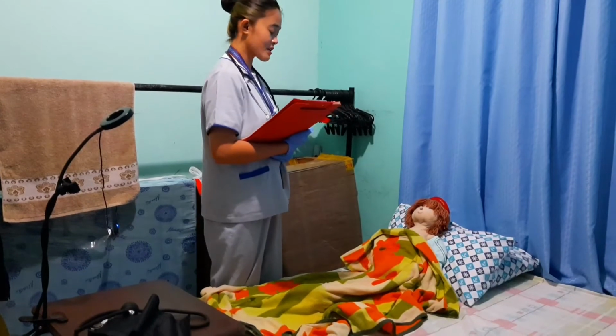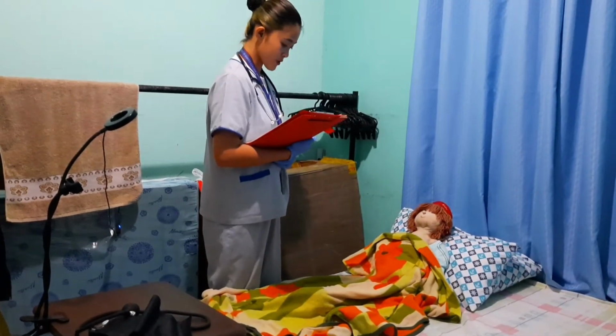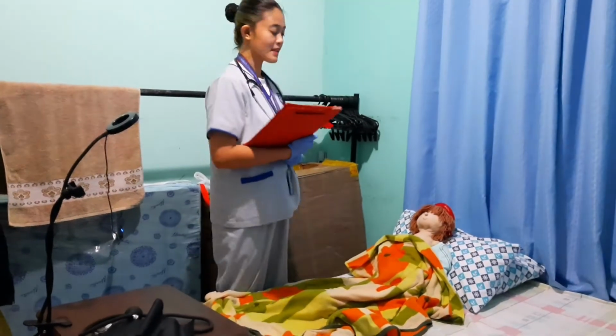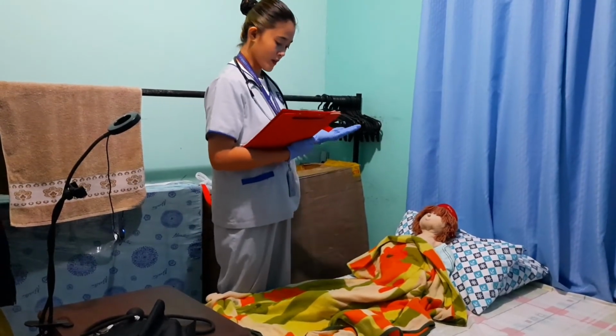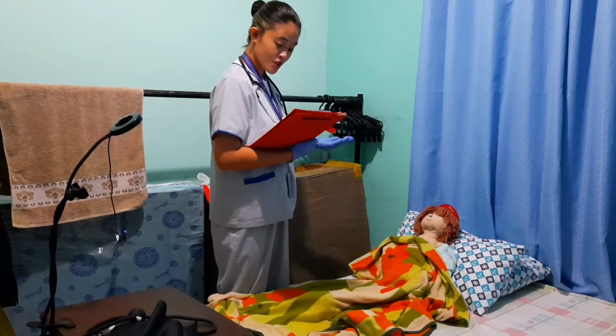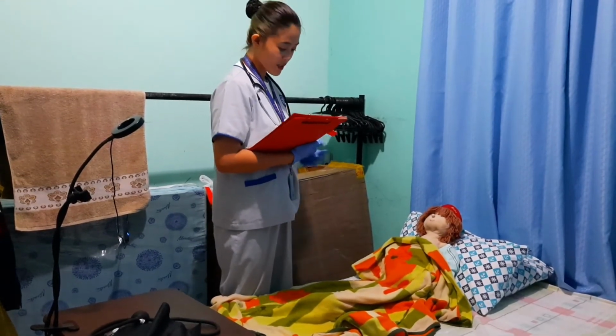So we're done taking your vital signs. And earlier, we've done the perineal care, so we will not do it anymore. And now I'm going to prepare the Perilight at the bedside. And I've already done the hand hygiene. So now I'm going to position you in a dorsal recumbent position. And I want you to cooperate with me.